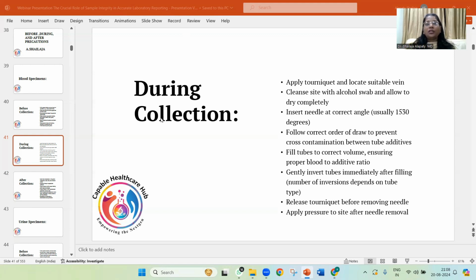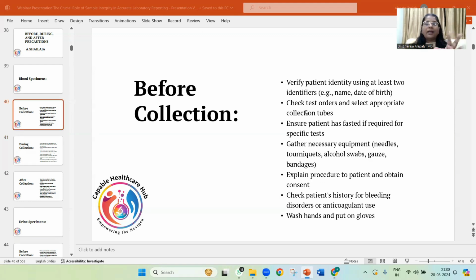Yes. So that TAT is totally out. The sample integrity is out. So actually TAT is from the time the doctor orders a test to the time the doctor gets a value for the decision to be made on the treatment. Because once the doctor says, I want sodium, I want potassium, because I want to treat the patient now because I feel his sodium is low. Now he orders a test. They go for billing. After 2 hours, the billing comes. Then the sister, after 2 hours, will collect the sample. What is the sodium value in the patient's body? And when is he getting treatment? So when you say emergency samples, they say 1 hour TAT. Why are they mentioning 1 hour TAT for emergency samples? But for the regular samples, 12 hours also is okay.